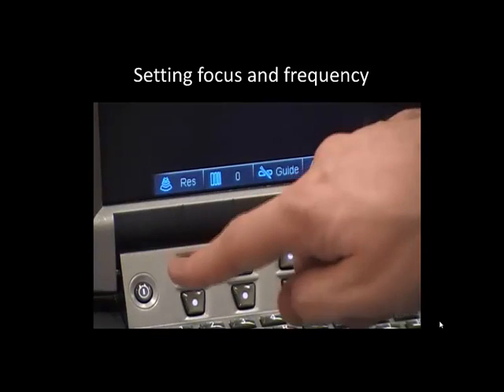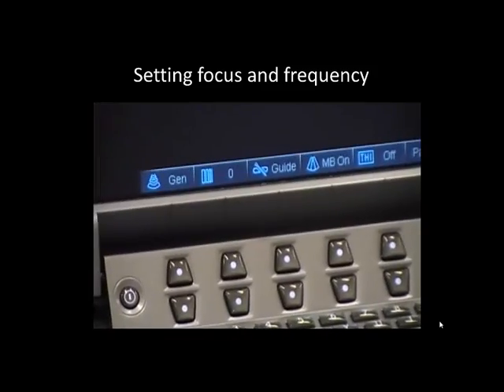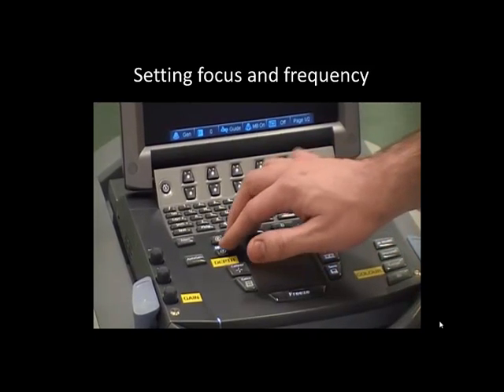The frequency of the probe should be set to the low range and the focus and depth also set appropriately. An initial depth setting of at least eight centimeters is usually required.